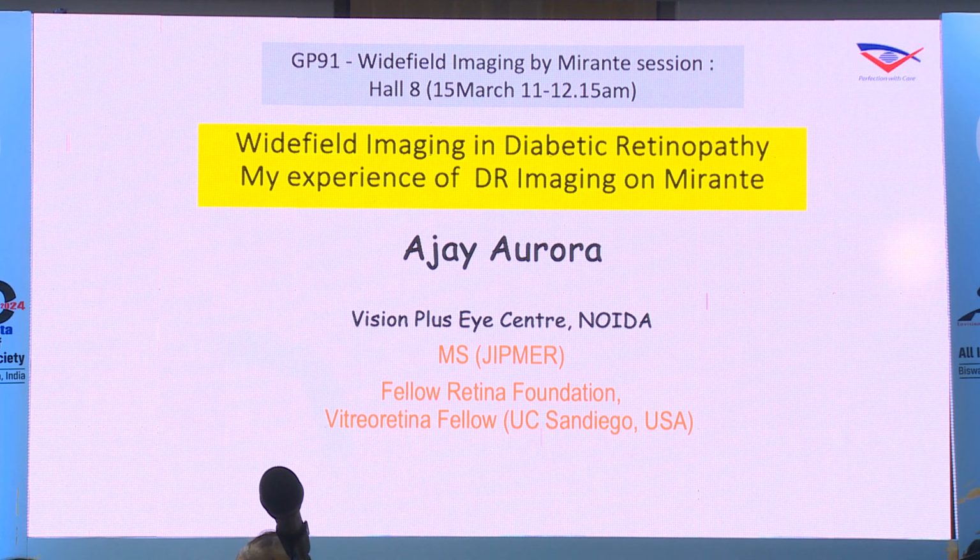So I have kept my old fundus camera with me, but there is a scale below on the Mirante where you can adjust the colors. When you adjust those colors to near what you would get in a normal fundus photograph, we have to do it initially. Once you do it initially, all subsequent photographs with the same color combination would come out safe. So that is the only trick which is useful.